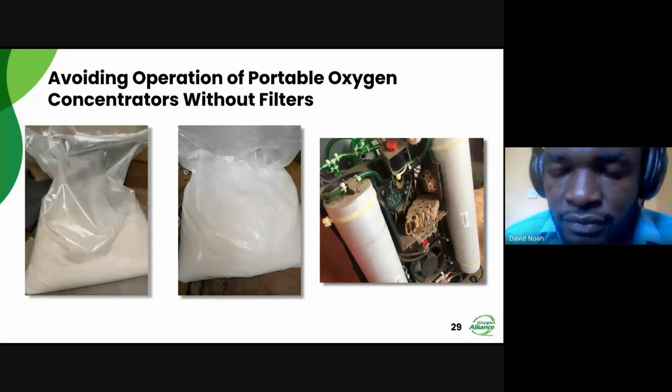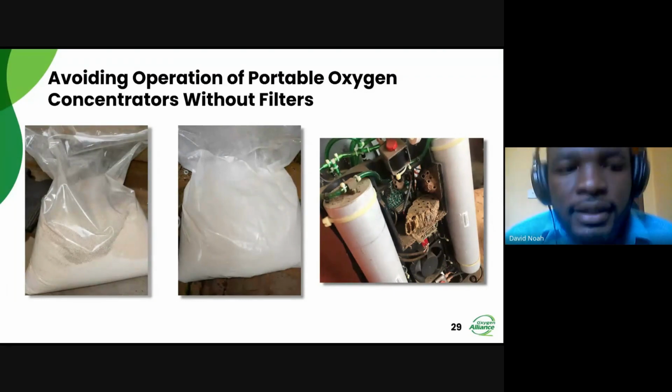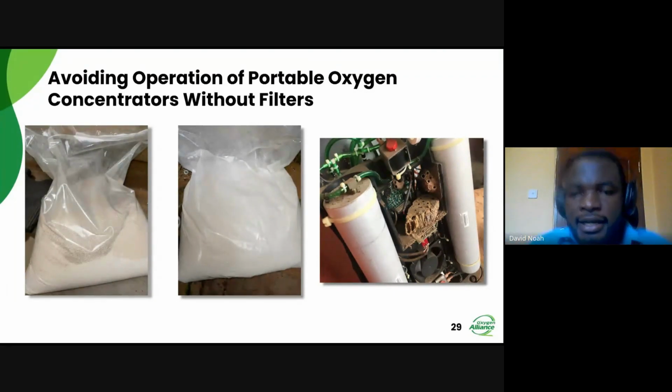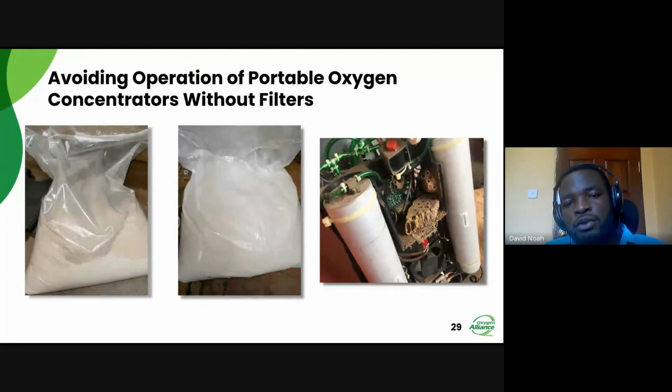So if the concentrators are operating without HEPA filters or gross particle filters, the debris and dust can accumulate in the system and hence pass to the compressors, which may lead to wear of the caps in the compressors.